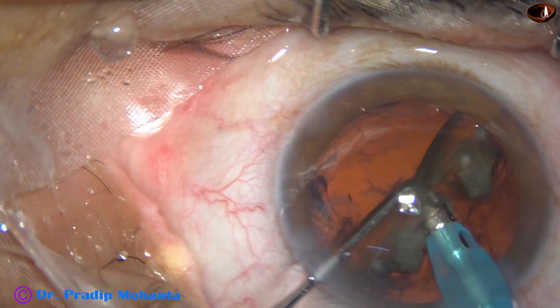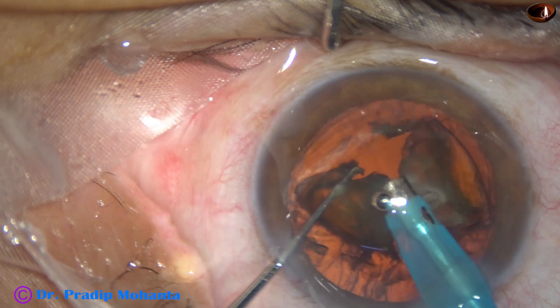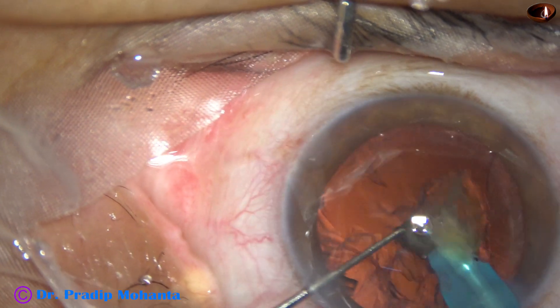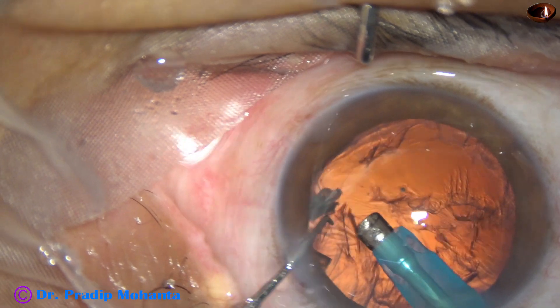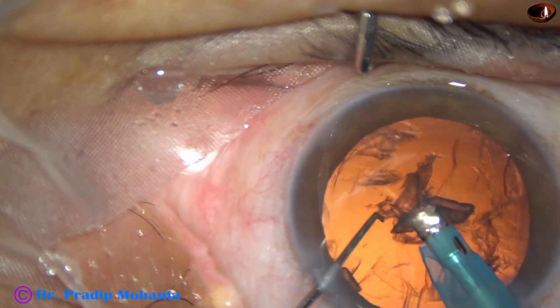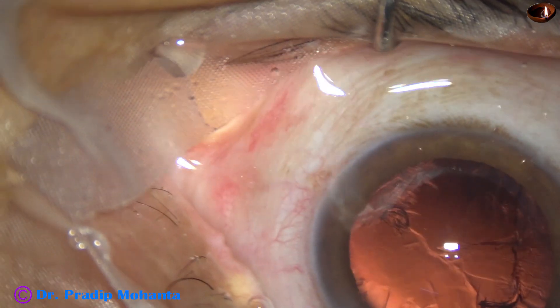This is the other hemi-nucleus. It is tumbled. This piece is subdivided into smaller pieces. Now for the last piece, we can reduce the parameters — vacuum and flow rate may be reduced for safe emulsification of the last nuclear fragment. And now this is the epinucleus. It is removed, and now we come out.